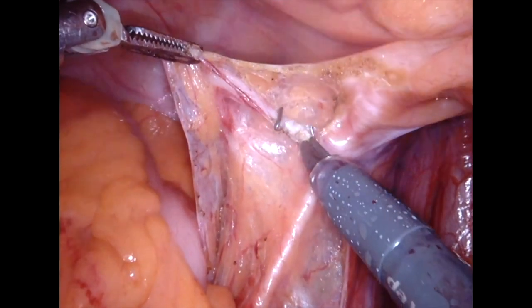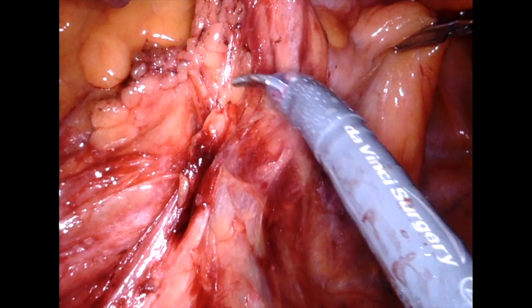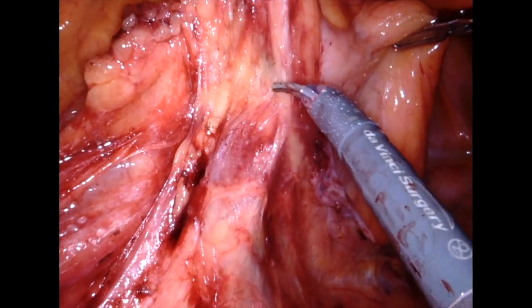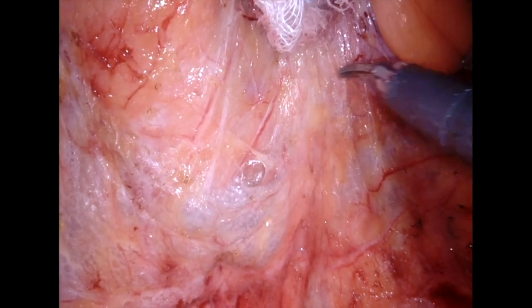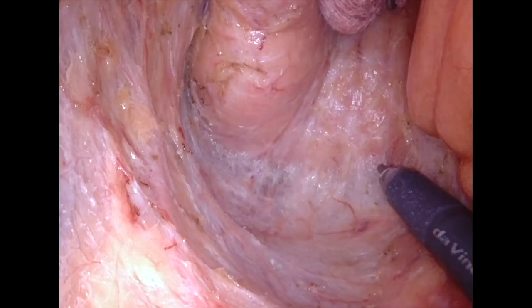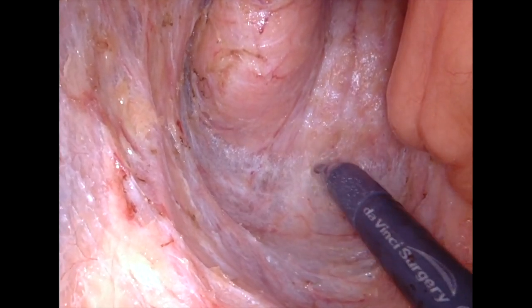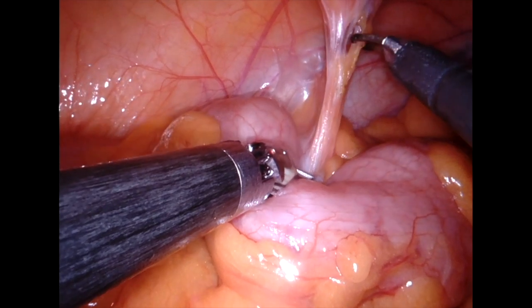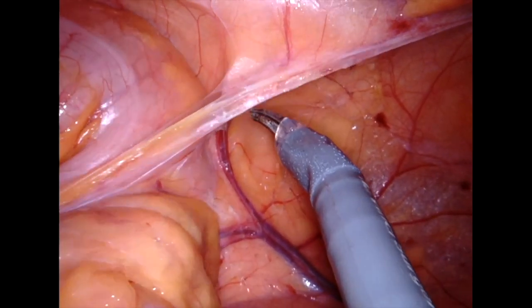Dissection continues in the avascular plane underneath the superior rectal artery, and mobilization of the rectum in the pelvis is done in the standard TME plane. The rectum is mobilized off the presacral fascia down to the pelvic floor. Colonic mobilization is completed after scoring the lateral peritoneum and mobilizing the colon till the splenic flexure.